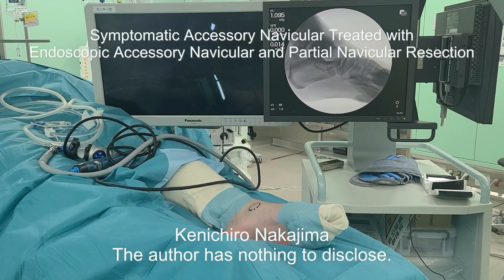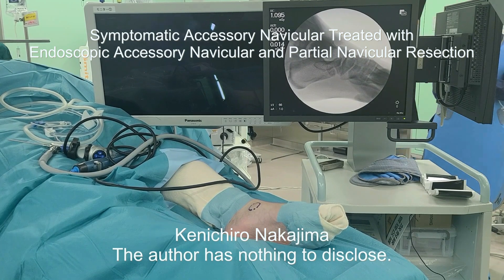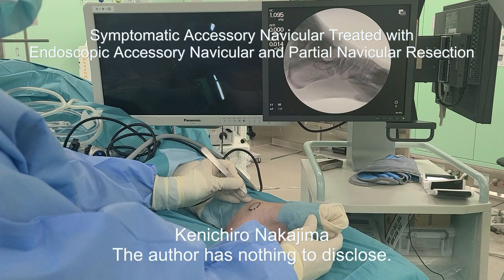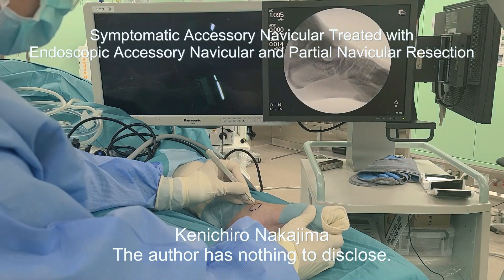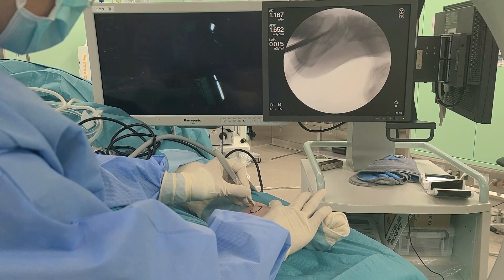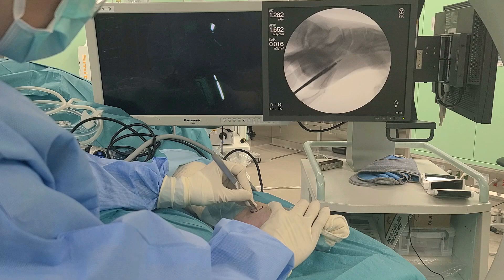Symptomatic accessory navicular treated with endoscopic accessory navicular and partial navicular resection. The foot is placed on the table with the lateral side facing down. On the medial surface, two planned portals are marked 1 cm away from the edges of the synchondrosis, between the accessory navicular and the navicular.